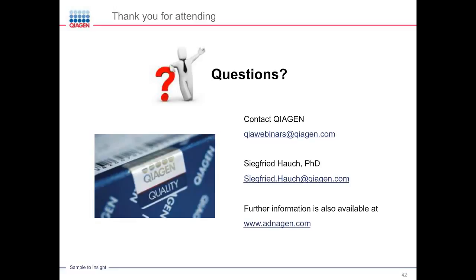That had been actually very preliminary experiments, I have to admit. So that was not our focus in the past, but we do more and more work on that because we have seen at least the proof of principle for colorectal cancer was there. And we also got an interesting finding in that case because we could see that the KRAS mutations we found in the CTCs were not necessarily also found in the tissue, and vice versa.